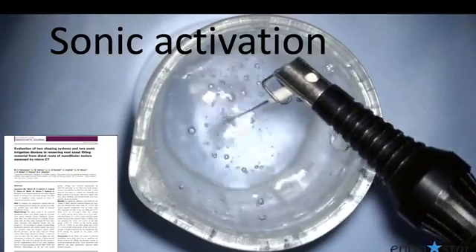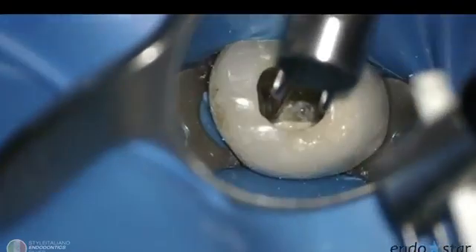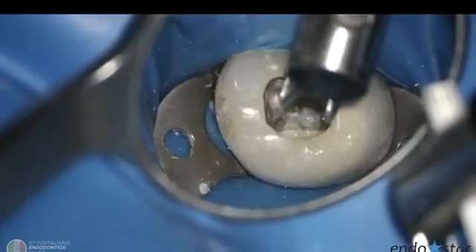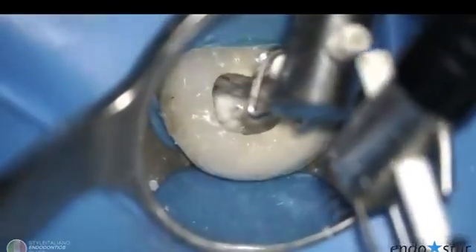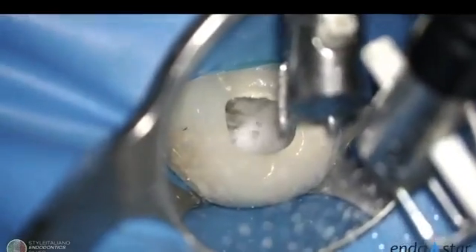You can see this will do some cavitation inside liquid and acoustic streaming that will give me the opportunity to remove even more debris. On the left, this is the article we did about this instrumentation, and we showed that when we use a sonic instrumentation, and another article shows when you use ultrasonic passive activation, we can remove more debris from inside the canal. So this is a prototype, and you can see how it works inside the canal. Here too, debris are coming out by doing this acoustic streaming inside all the canals. First of all the distal, then the mesial canal in this mesial root, and finally we will do it also in the palatal canal of the case.